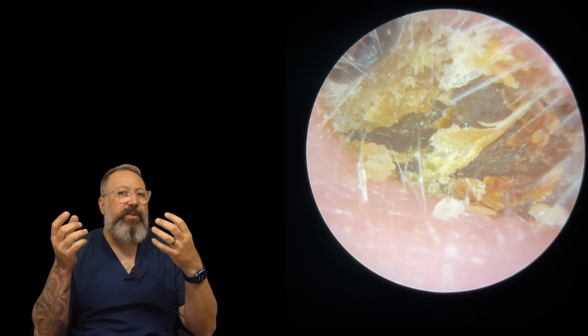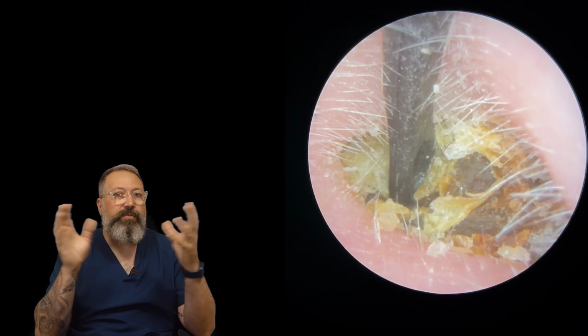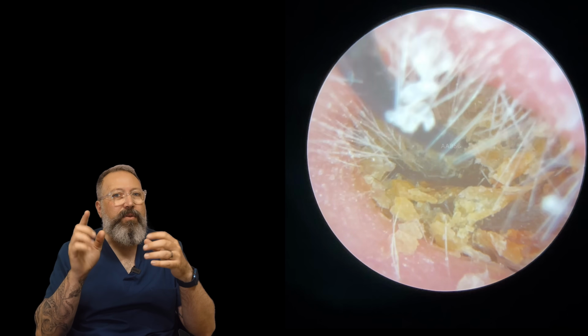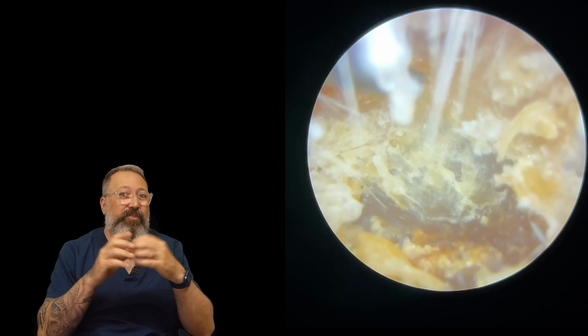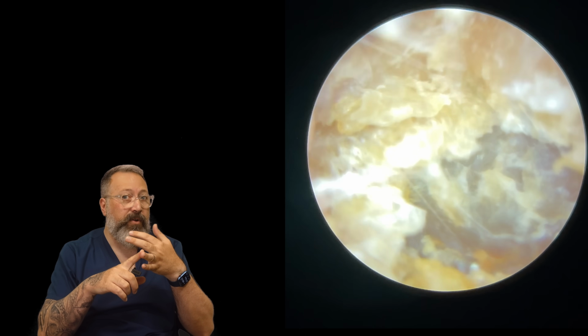So sometimes patients, when they put the oil in one ear, they get so blocked up, they think, oh my goodness, I'm not doing that on the other side as well. I'll be totally blocked up on both sides. But you can see we're fighting with this. Now, I've tried suction tube, didn't really break it down. We've tried Jobson Horne, that didn't really break it down either.